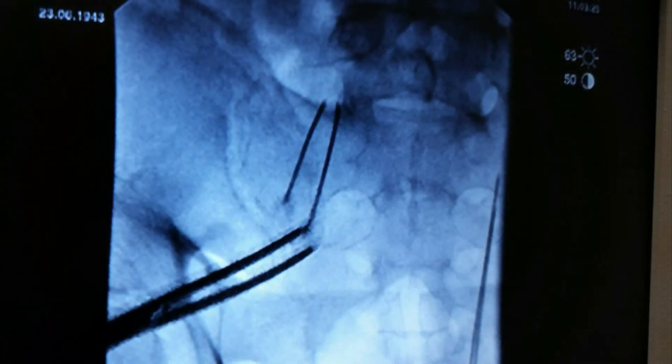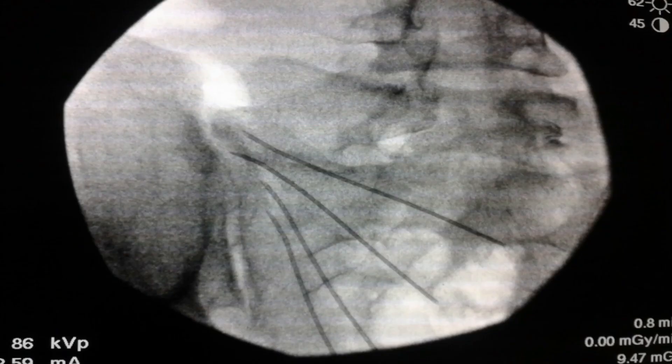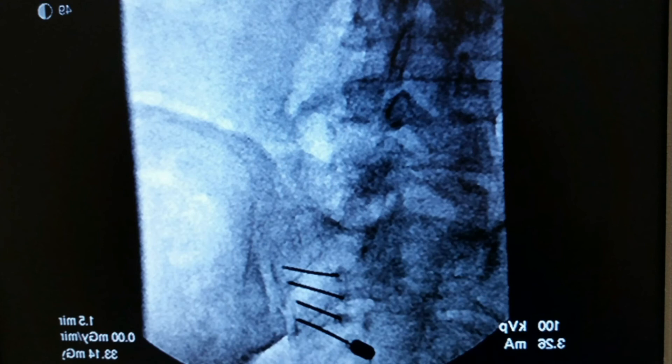This is an x-ray demonstration of how we use the alternative technique. First, we make a lesion at L5, S1. Then, we make a lesion in the upper half of the SI joint and its supporting ligaments. Finally, we make a lesion in the lower half of the joint.